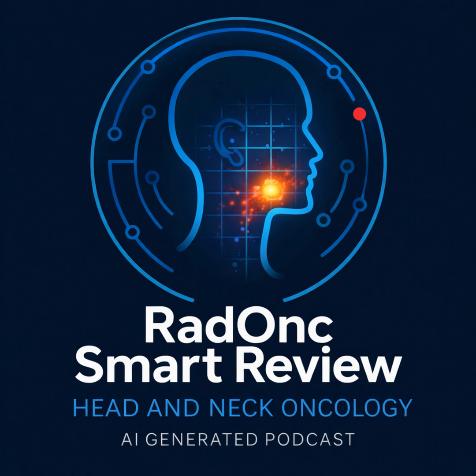Okay, let's break those down because I think they're often glossed over. First, the fibular free flap is a highly heterogeneous target. It's got bone, which is high-density, soft tissue, and then titanium, which is an extreme density. Protons are exquisitely sensitive to density changes. The presence of that titanium plate introduces massive uncertainties in the dose calculation, and that could potentially lead to dangerous hot or cold spots right at that critical flap interface. Okay, that's heterogeneity. What about mobility?